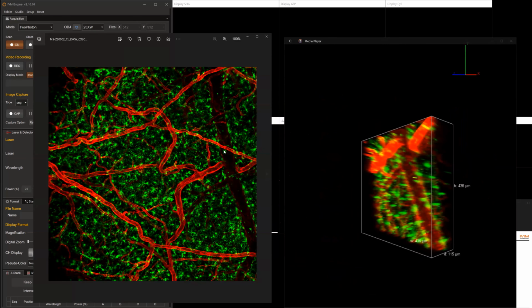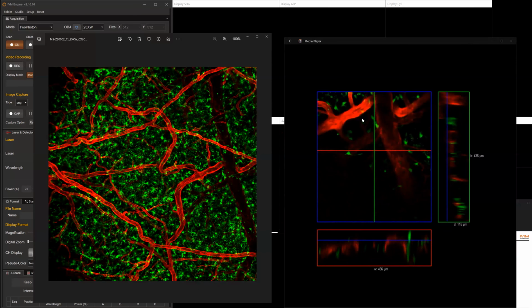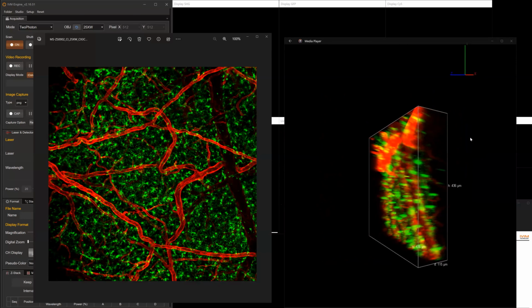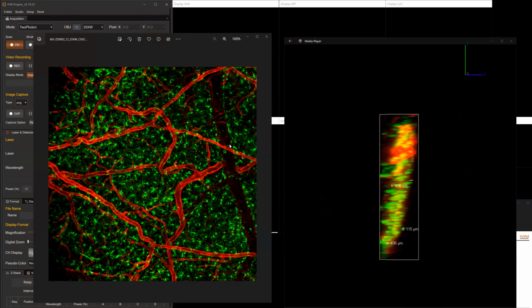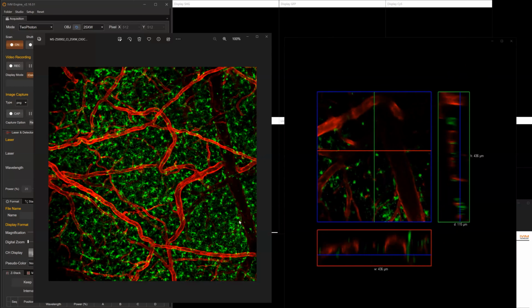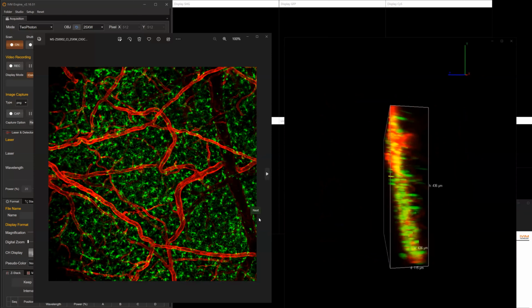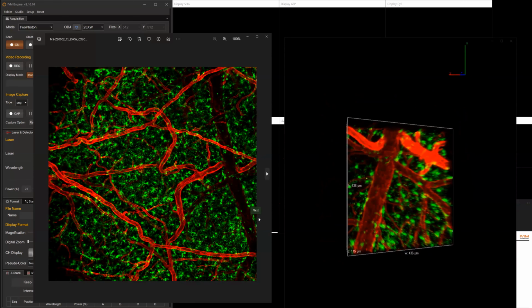On the middle right side of the mosaic part, you can clearly see a U shape, I mean an S shape, with large branching structures in the cortex. Look how wonderful an in vivo brain image we could get from the live mouse.